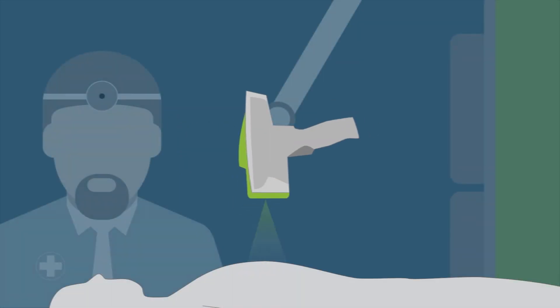How does IR skin really work? The dermatologist acquires a skin lesion image using a lightweight 10 megapixel camera with a magnification up to 100x.